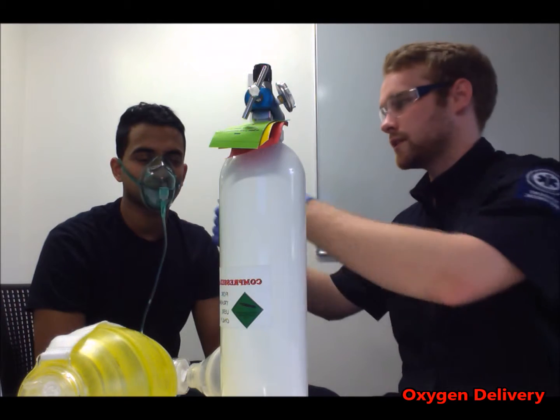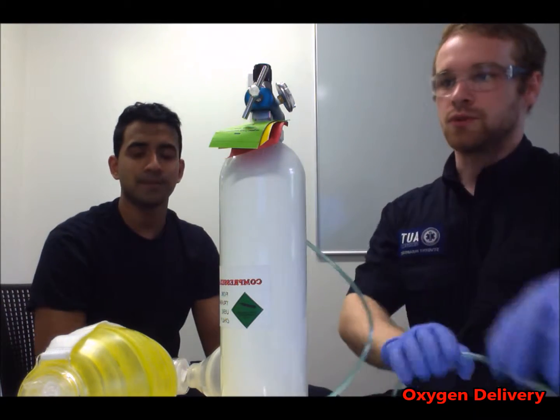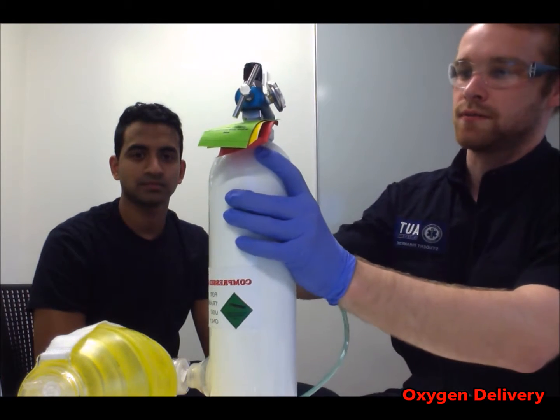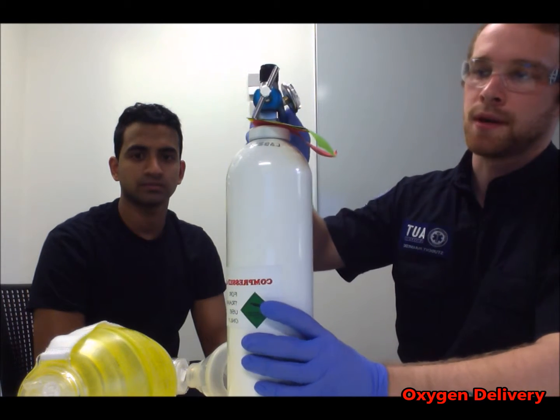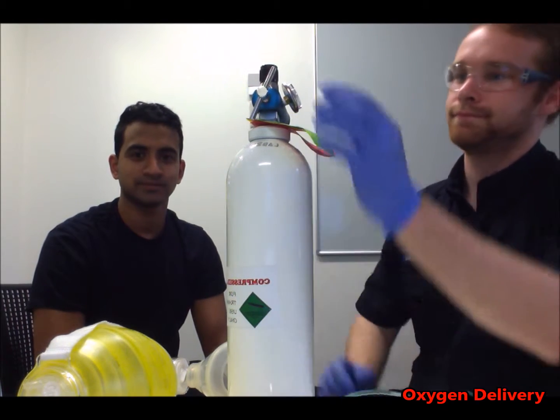Next I have to flush the O2. So I'm just going to take this off you here. So we'll turn off the oxygen and take off this valve. Take off this tubing, sorry. And next just turn it on, flush out any remaining oxygen in the regulator. And there we have it.